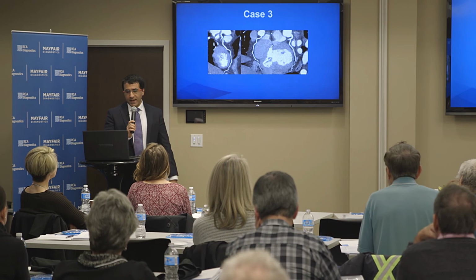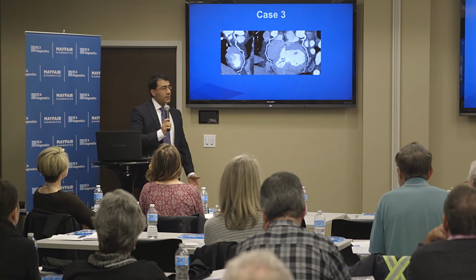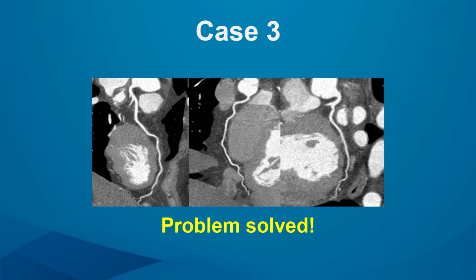So, sometimes we have patients worrying, but a lot of times we have physicians worrying. And I think it's for a good reason, because this patient's diabetic. He's on insulin, and they want to make sure that it wasn't a false negative maybe. And again, we did the CT, perfectly normal coronary arteries, and the problem is solved.